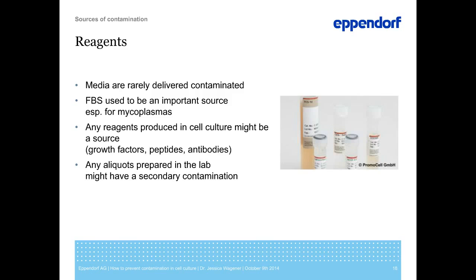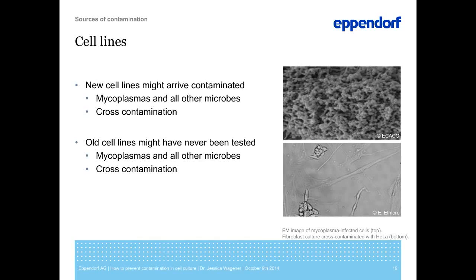Let's first talk about the risk when working with cell lines. If you introduce a new cell line into the lab, you have a potential risk of introducing a contamination to the lab. Also, you might rely on older stocks that simply have never been tested. If you have never tested old cell lines, please test them immediately to make sure that they are clean. Remember the numbers we have been seeing before? 6% of the cell line stocks thought to be clean were contaminated by different microbes.